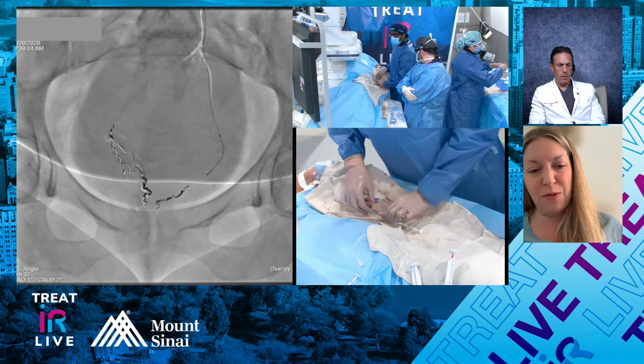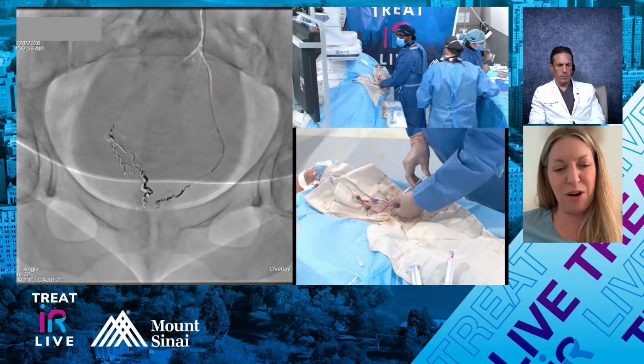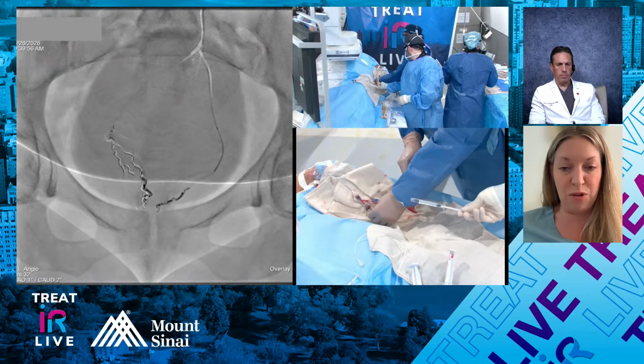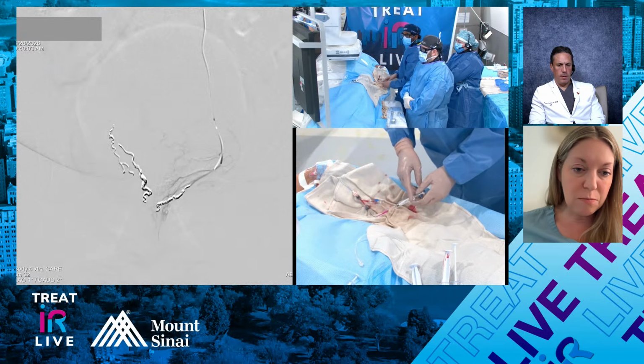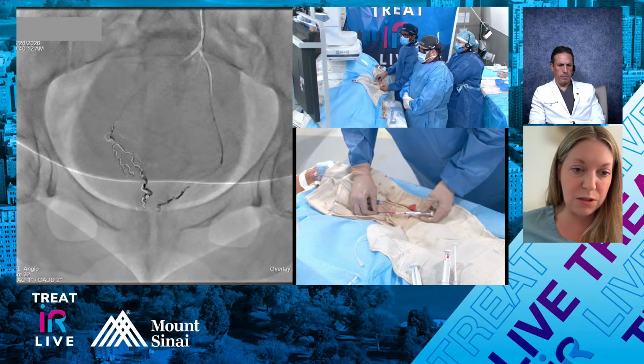I guess we'd have to think about, are you going to have to be switching out catheter things? I think you can certainly go radial with a longer radial catheter, and that might solve all those issues. So I think that would be fine. I've done femoral for them too, and then catheter changes aren't such an issue either.